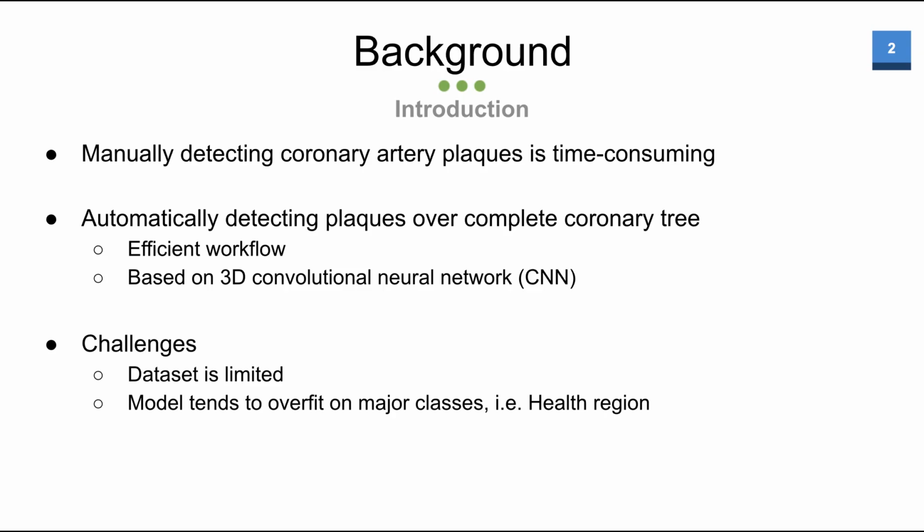The challenge is that collecting large amounts of CCTA scans with annotations is very difficult. In addition, the plaques only account for a small part of the coronary tree. Hence, the model tends to overfit the healthy region, which is the major class.